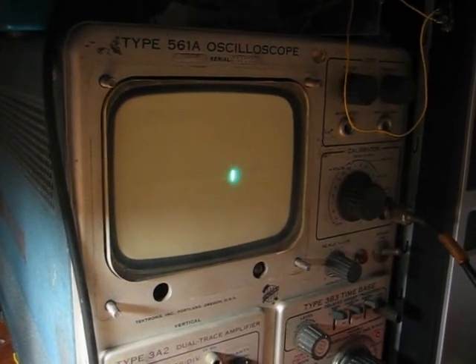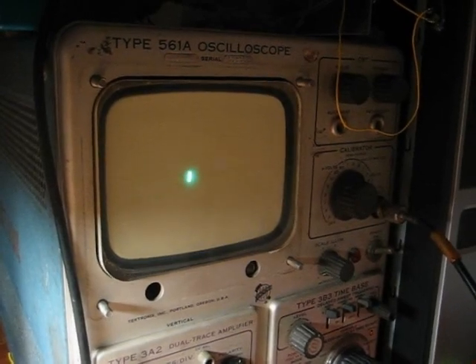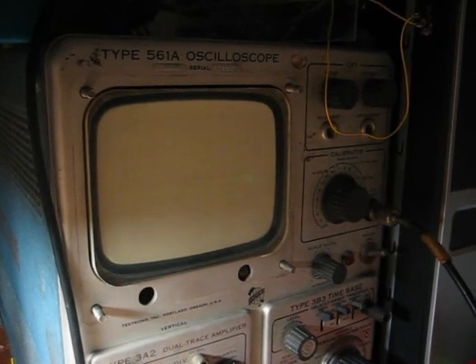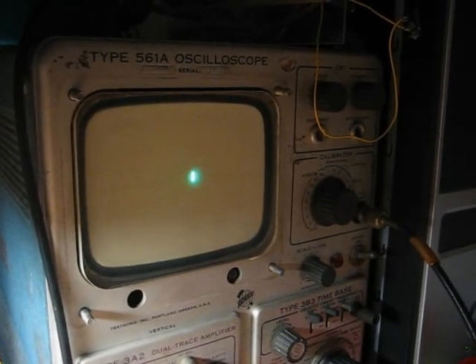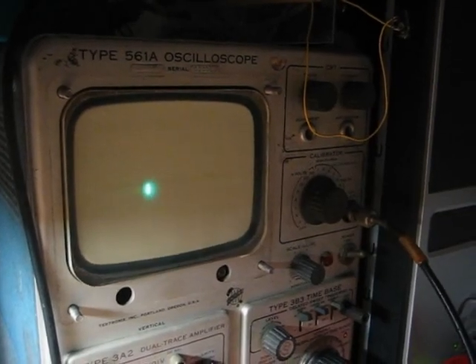What you're looking at is the output of my simplified ECG machine, and the output is being displayed on an oscilloscope. You can see about once a second that little dot makes a sharp up and then down motion. That corresponds to the electrical potential across my heart, causing my heart to beat. And this is being recorded from two electrodes, which are just pennies taped to my chest.